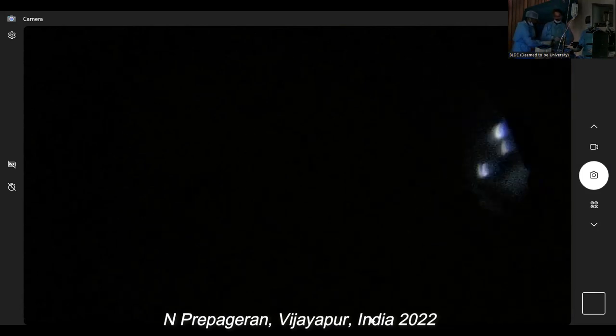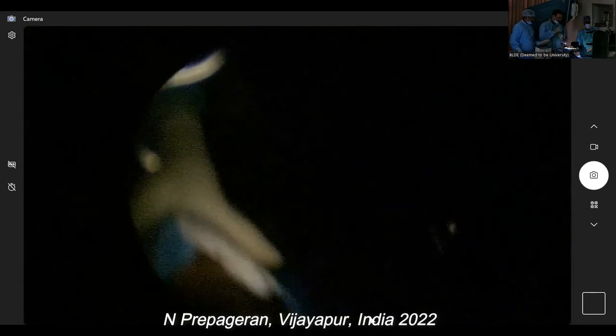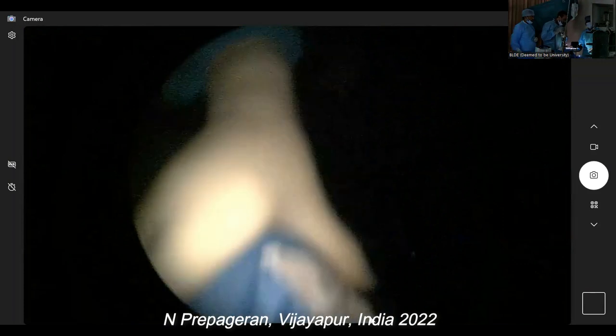So do the dissection exactly like how we do in real-life surgery. And you can see how I've preserved everything. Yes, sir. So do it exactly like that when you do the dissection. Hey, but guys, it's not clear with the 30-degree scope. Can you increase the light to maximum there?